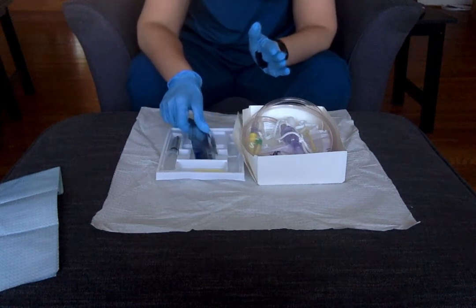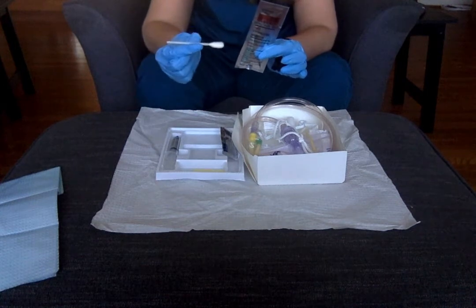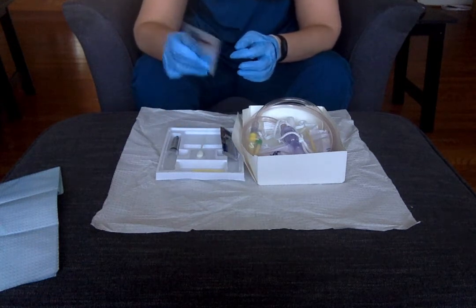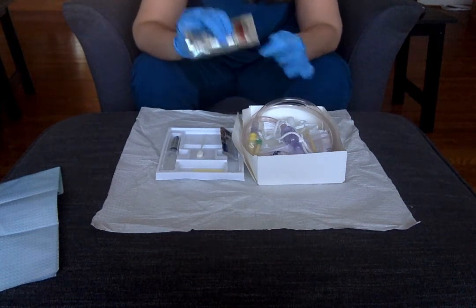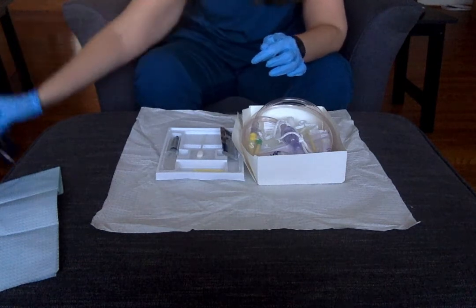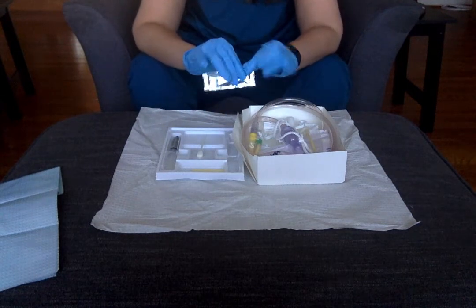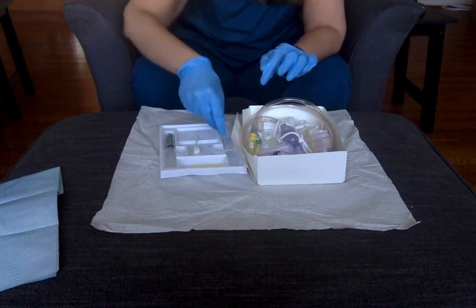The first thing you want to do — I have swab sticks in mine; you guys have cotton balls. It doesn't matter either way whether you use the swab sticks or the little forceps with the cotton balls. You're still going to open the Betadine — we're going to simulate so you don't make a mess. Open your Betadine and pour it over your cotton balls or swab sticks. This then becomes trash. Then I've got to set up everything else in my kit, so I want to open my lubricant — yours is probably in a syringe — open that and squirt it into your tray.